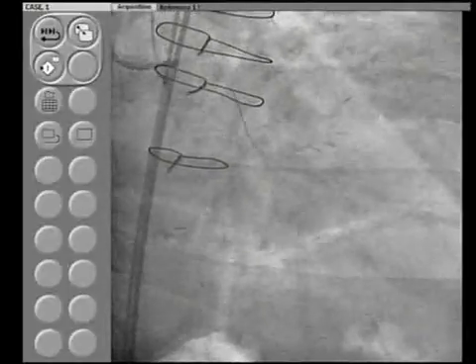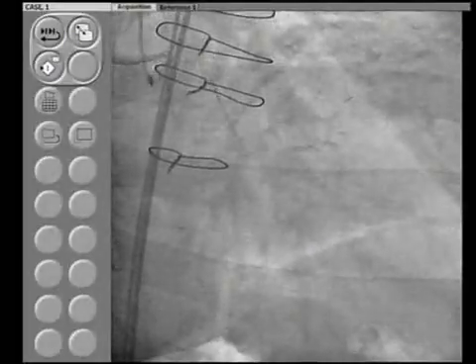Now it gets very complicated here. Complicated in the sense that multiple channels have been created right from the beginning. And how do you do it? Whether you leave this wire a little bit and then go with the side by side, or how you do it. Now let me see. This looks a little better. Little dye.